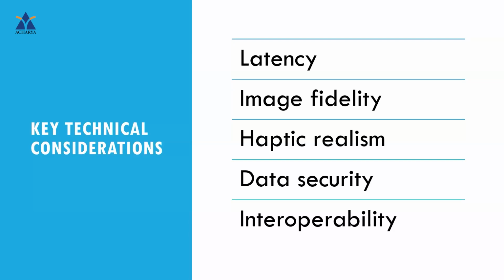So you'll have to minimize the time gap between the physical procedure and the replication of it on the system. By minimizing the delay between the user action and the feedback, you can create a more realistic simulation. So you will require optimized hardware and software so that the latency period is less. And image fidelity. So you will require high resolution 3D models for accurate anatomic visualization. By having better 3D models, you can realistically bring out the tissue textures and blood flow.